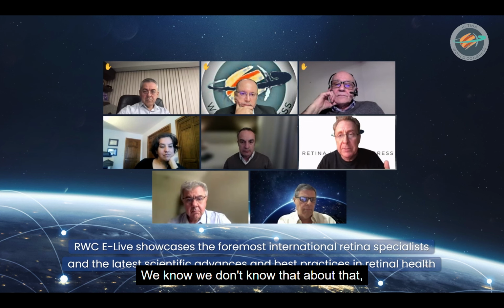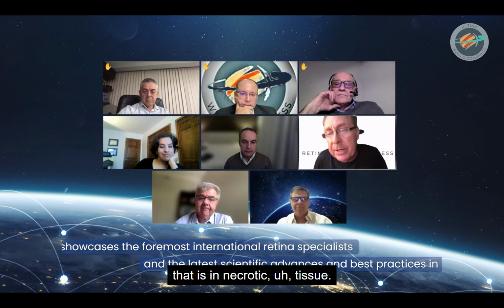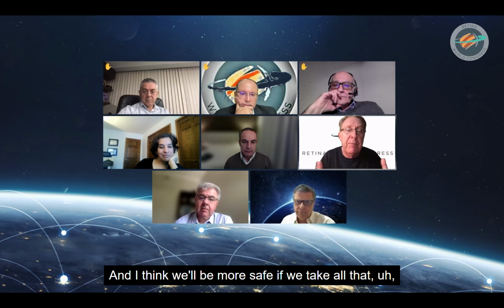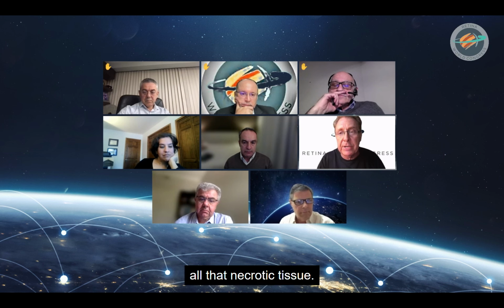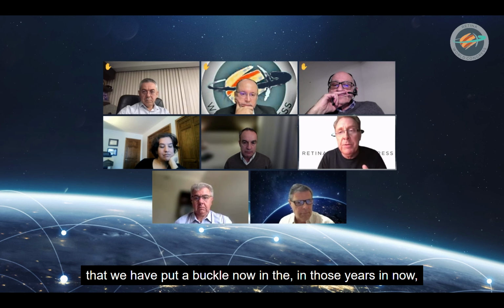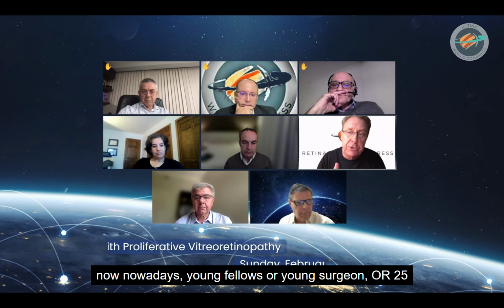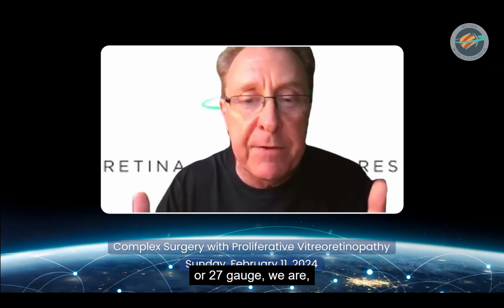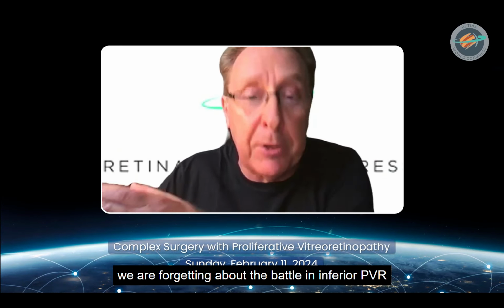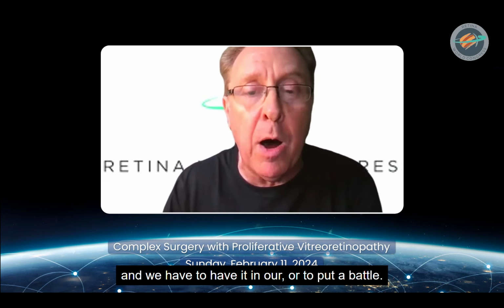We don't know about that, but in our practice, I like to do that. It's necrotic tissue, and I think we are safer if we take all of it. Obviously, in this kind of case, I absolutely agree that we have to put a buckle. Nowadays, young surgeons, with 25 or 27 gauge, are forgetting about the buckle in inferior PVR, and we have to have it in our OR to put a buckle.